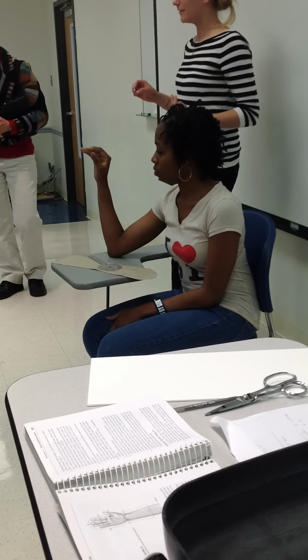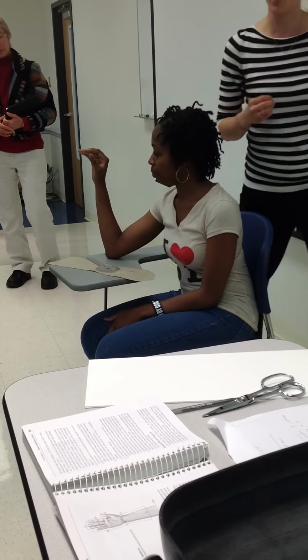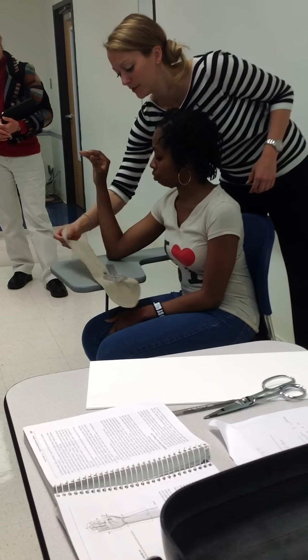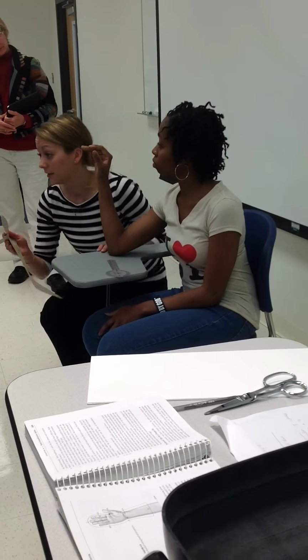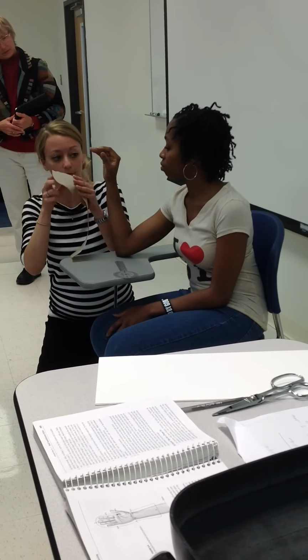Once again, it's one of those things where if you're on for almost all of your measurements and just off a little bit, do you really want to put your whole splint back in to correct it? Got to think about it.